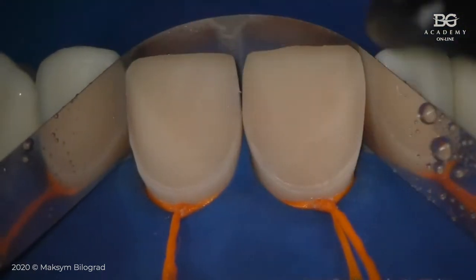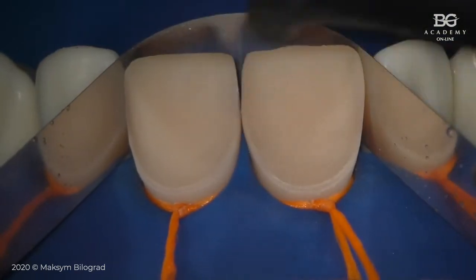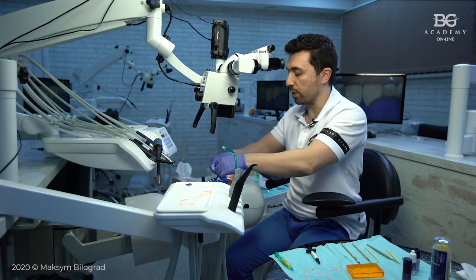The surface of teeth are clean. We need to do sandblasting when you have filling, to get some micro-mechanical retention. I do like to work with sandblaster also when I have just enamel, just to clean enamel, and everything will be ready for bonding properly.